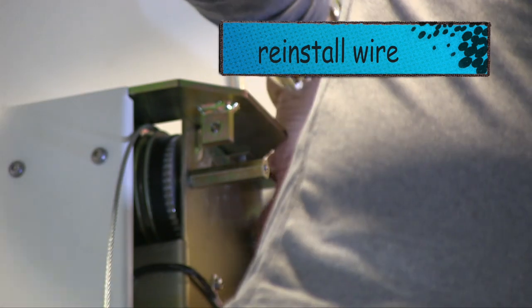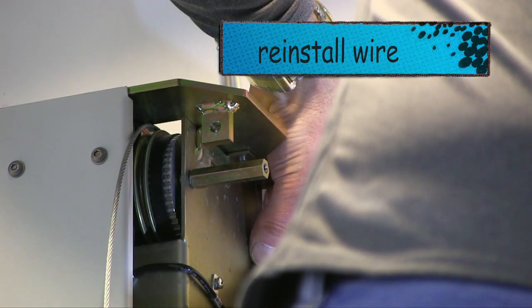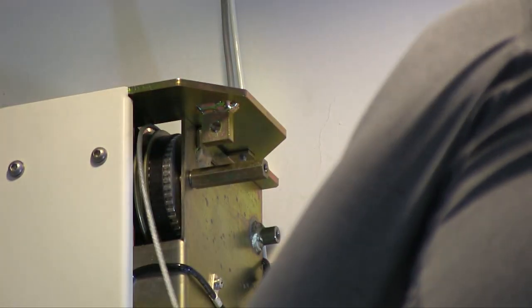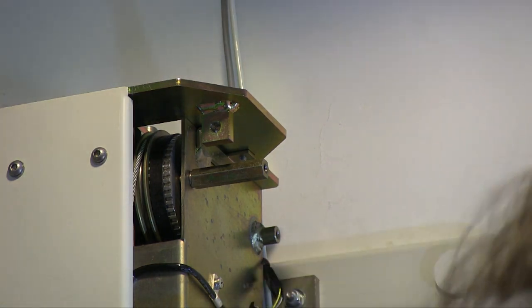Plug the motor back in, which is right over here. This might have to really screw it up. Nope, snapped right in. All right, see right where the other one was. Now, make sure these are attached. I'll tighten these back in. Home stretch, baby. Home stretch.